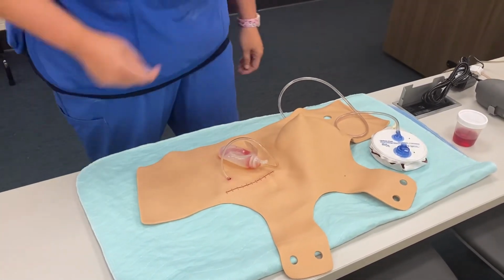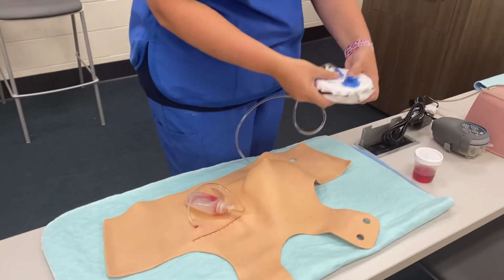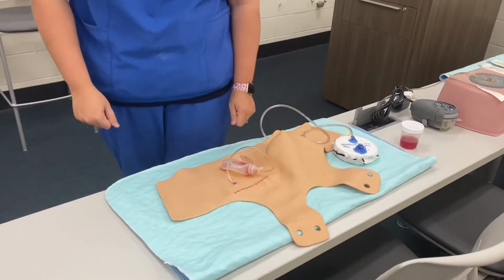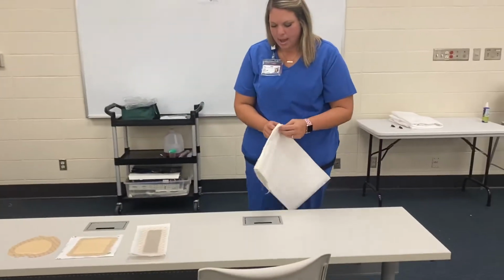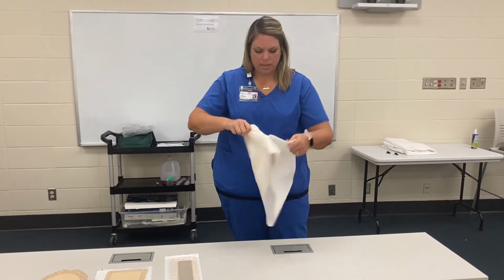Okay, so when you come to lab, y'all can practice laying hands on it, playing with it, opening it, squeezing it back, closing it, just to get familiar with what these drains are and how they work, okay? The next station we talked about some nursing interventions and preventing complications with our patients' wounds.